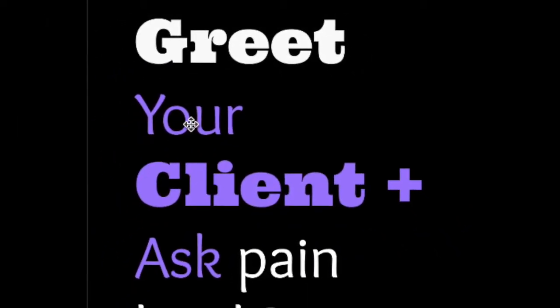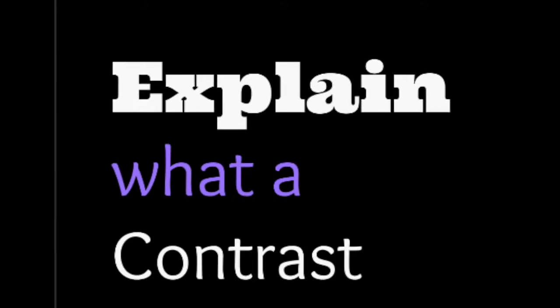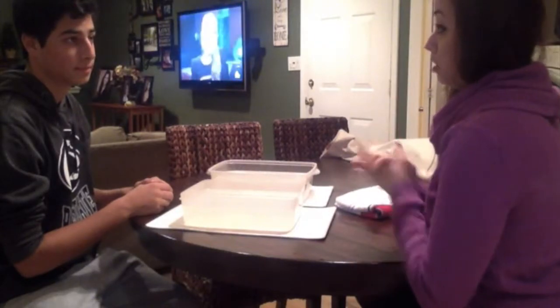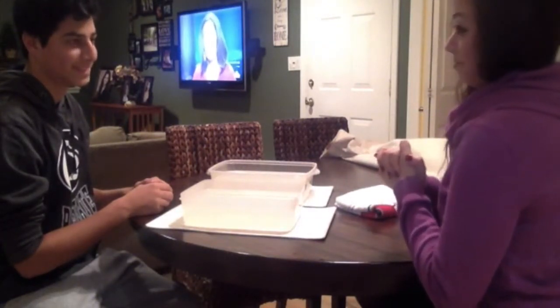Before your client comes in, you should already be prepared for the contrast bath. This should have been previously talked about as an implementation of their intervention plan. Make sure that when they come in, you greet them and ask them what their pain level is. Also, make sure that you check for understanding that the client knows exactly what the procedure is for and how it was done.